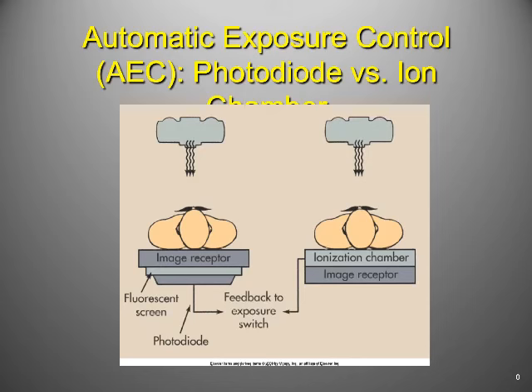Okay? Here, I'll show you an illustration of what I mean. We have this triad pattern of ion chambers, right? And I want to make an exposure of an AP, let's say PA chest X-ray, right? So I'm going to draw really goofily. Here's the patient's thoracic spine, right? The anatomy in relationship to the phototimers. Let's say this is the patient's lungs, right? You tracking with me? This goofy drawing I'm making?